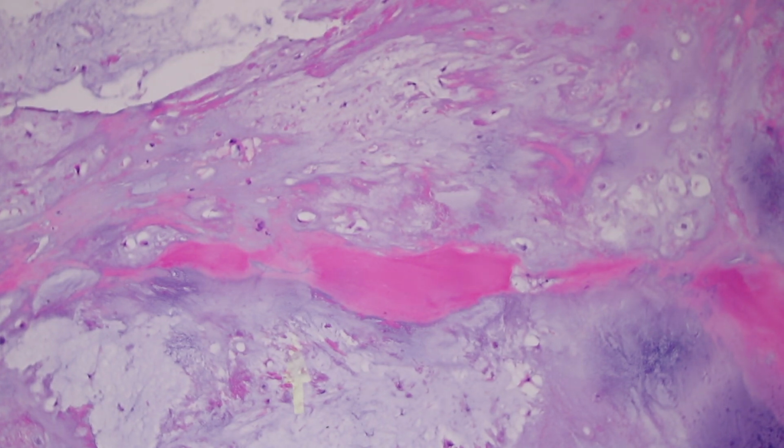So I'm going to rephrase what you said to me, that you're trying to distinguish mineralized cartilage versus pre-existing bone. Okay. Many times they're different colors. Cartilage often is blue. It can be pink. So when it's pink, it can be problematic. Pre-existing bone will always be lamellar. And so if this were lamellar bone, we should be able to see it. If this was bone, we should be seeing osteocytes.